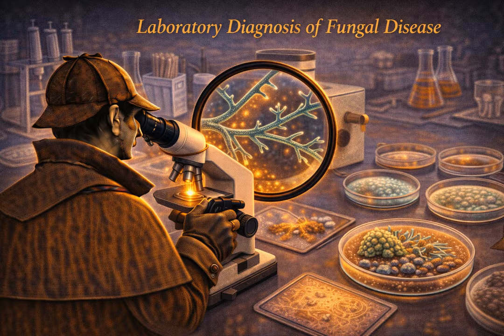But, and this is the vital key, it does not dissolve the fungus. Why not? Why is the fungus immune to this strong base? Because fungal cell walls aren't made of keratin or standard proteins. They are made of chitin. That's the exact same tough, rigid material that insect exoskeletons and crab shells are made of. Chitin is incredibly chemically resistant. It easily resists the alkali.